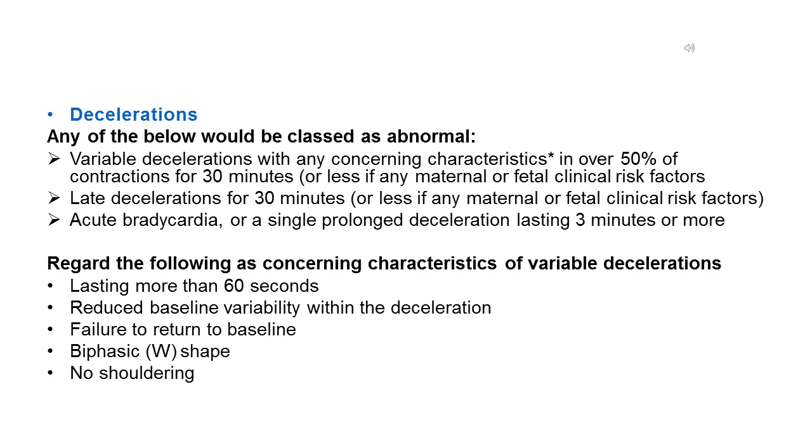Regard the following as concerning characteristics of variable decelerations. Lasting more than 60 seconds. Reduced baseline variability within the deceleration. Failure to return to baseline. Biphasic W shape. No shouldering.